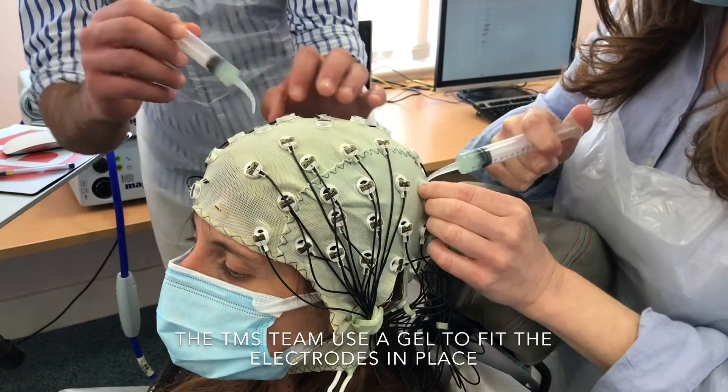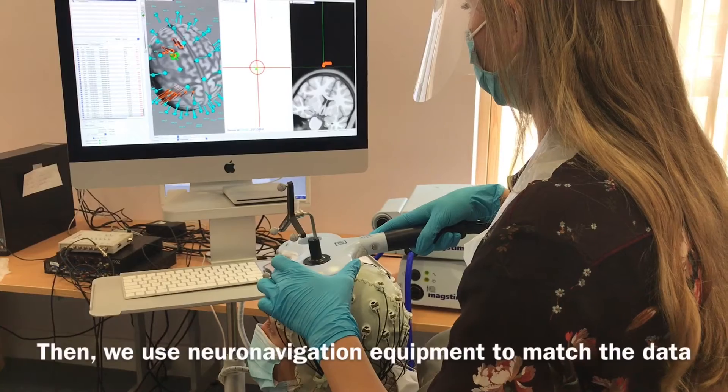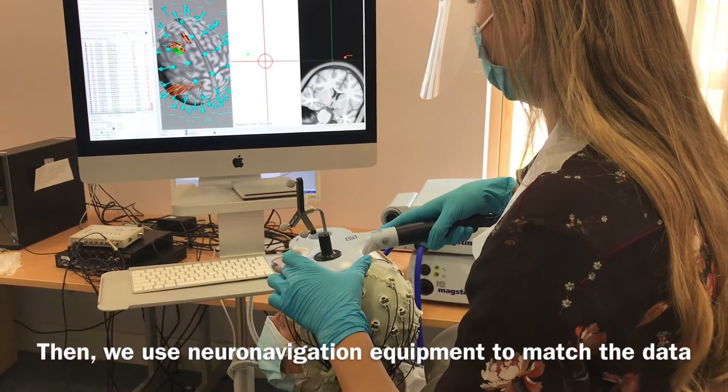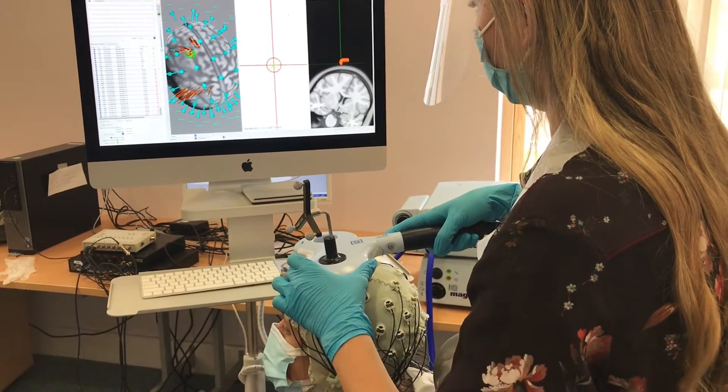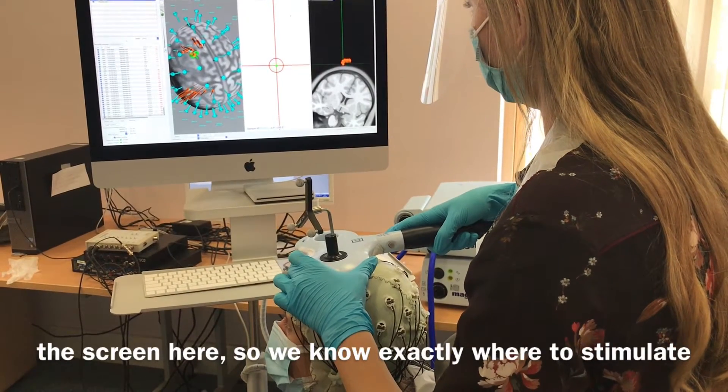And once we've done that, we can fit the navigation equipment to match the data from your MRI or from a template that we have up on this screen here. And then we know exactly where to stimulate your brain.